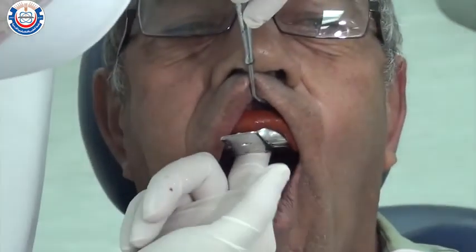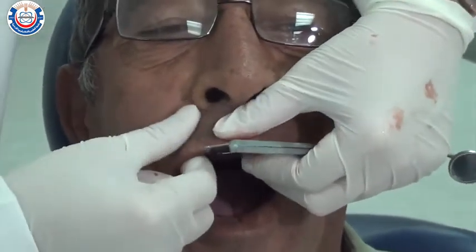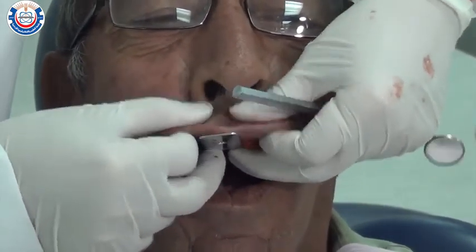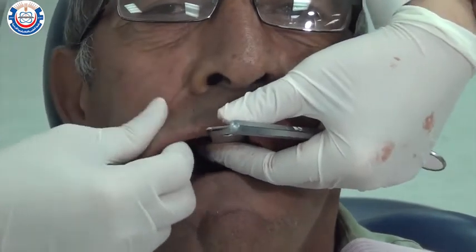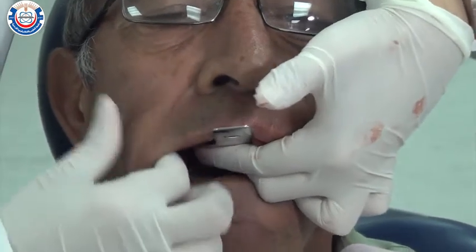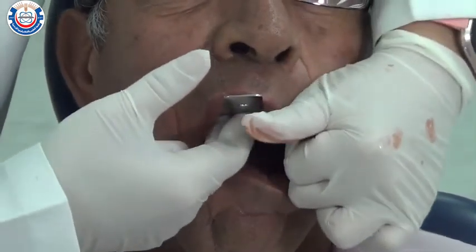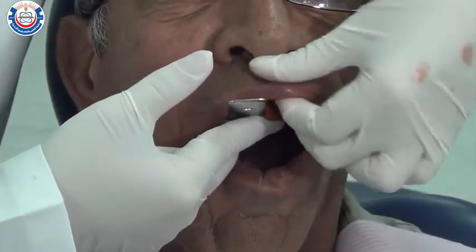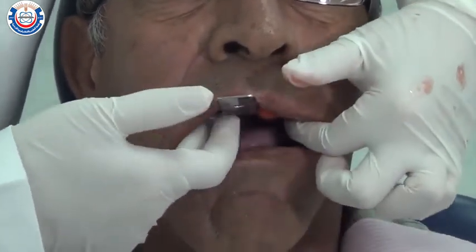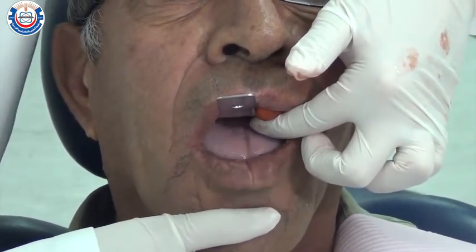Once the tray is seated, push the impression material firmly from the center of the palate using your thumb, and use your index and middle fingers on the ridge to make sure it's fully seated. Then start border molding the buccal and labial sulcus by moving the lips and cheeks in a downward direction. While the patient's mouth is half open, ask them to move their jaw right and left to border mold the distal buccal depth of the sulcus.